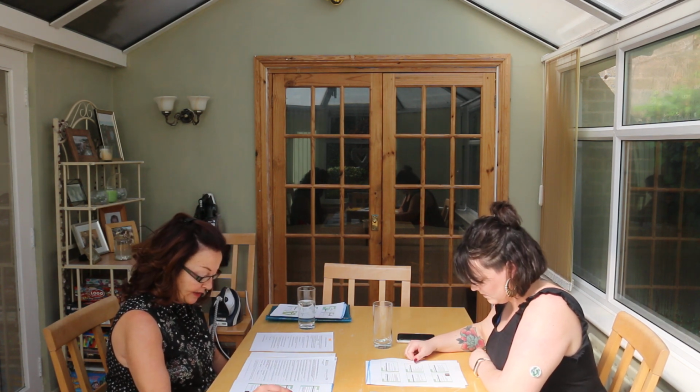So first of all, the most important thing is to check they don't have contraindication to using it. Assess the patient's ability to use it. Obviously in the hospitals now you have to have consent for everything. You have to make sure the patient understands what you're explaining to them. There is no age discrimination. I know when I was researching this as a project, some hospitals wouldn't let above 80-year-olds use it. I checked with BOC, there is absolutely no problem as long as they can hold it and understand simple instruction. It can be used for children as well.